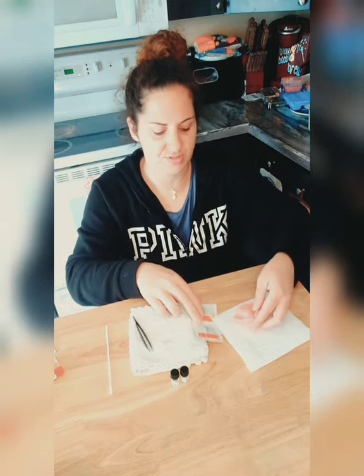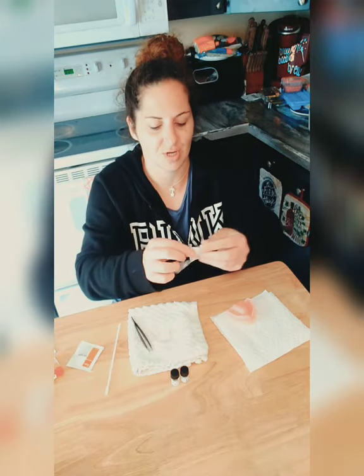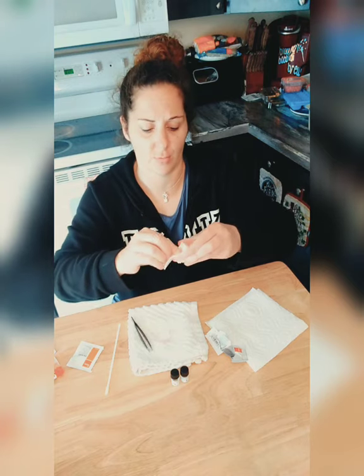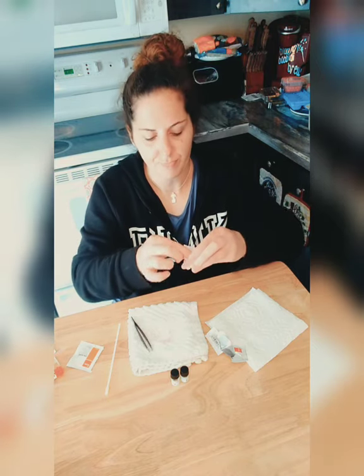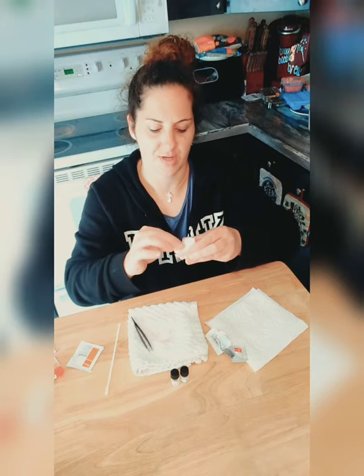I'm legally blind, guys, so I'm taking this Unisolve and going over all the acrylic, getting it in around everything to help loosen it up and do its dissolving thing. Then we're going to redo it — I'm going to do a separate video on how to redo your Denture Fit, which I've done before, but some people want an updated video.